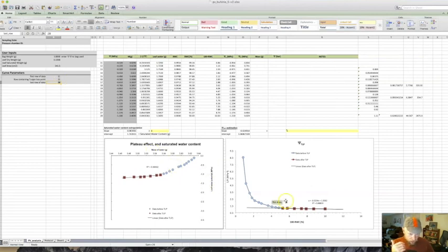All right, so now if I look at this after I put it to 22, these red lines are pretty smack dab on the linear line, and this first blue line is a little above it, as if it's still part of that curvilinear part. If it were part of the linear, this line would run right through the middle of that symbol, and it doesn't. So right now I'm starting to feel like I'm getting close. If I go to 23, that line runs pretty close through the middle of that symbol, and so I would say it's probably somewhere between 22 and 23.